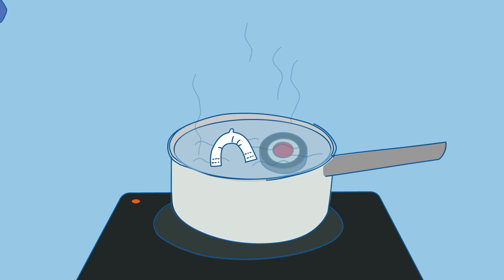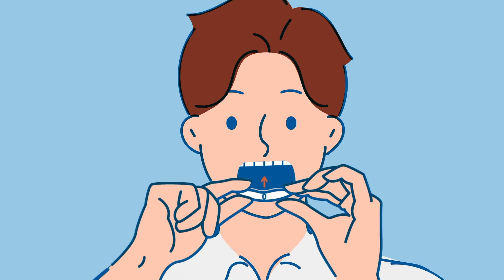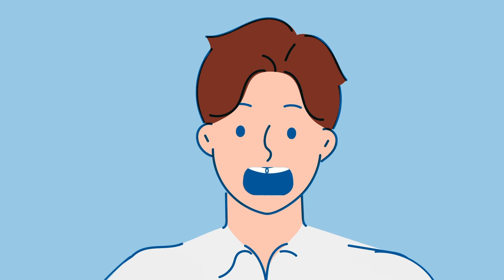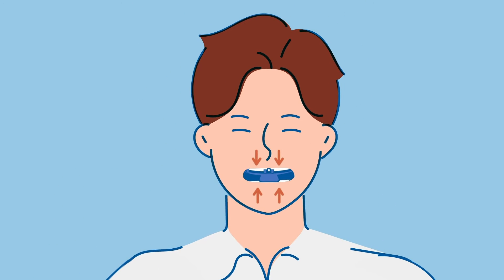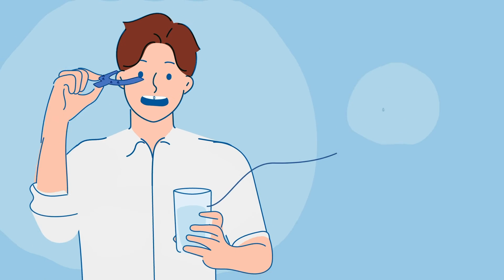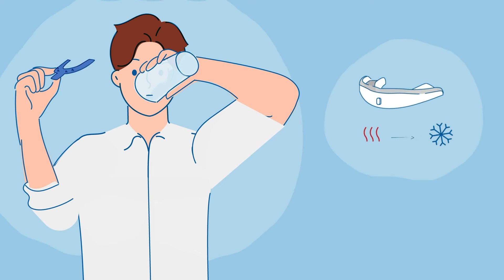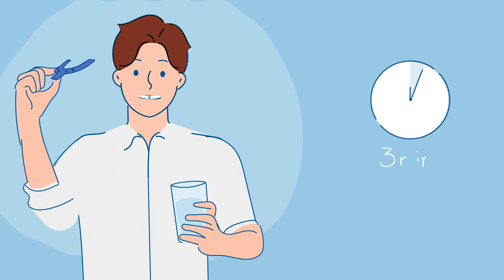Remove the mouthpiece from the pot and shake out hot water. Stand in front of a mirror and place the mouthpiece on your upper teeth. Be sure to center the hook and slot between the incisors. Insert the impression board under the mouthpiece and bite down hard for five seconds. Press on the edges of the mouthpiece for a perfect molding of your teeth's surfaces, then release pressure and remove the impression board. Rinse your mouth with cold water and let cool for three minutes.